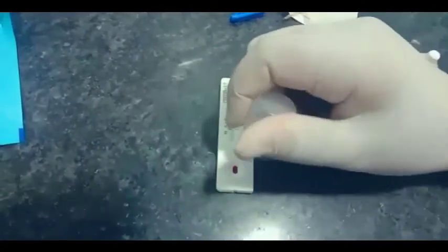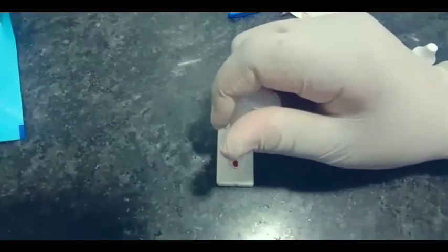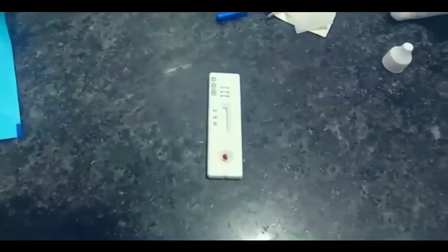Add 2 drops of assay solution. Within 3-4 seconds, it will start running, and within 1 minute, the control band will appear.